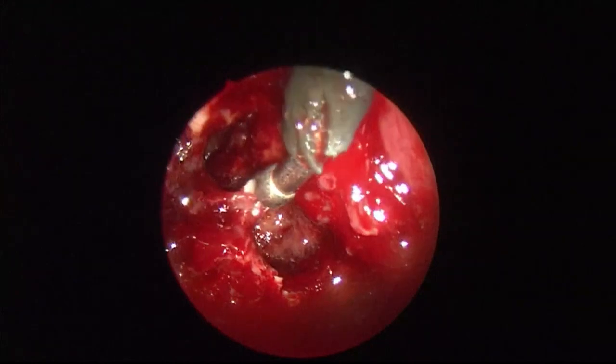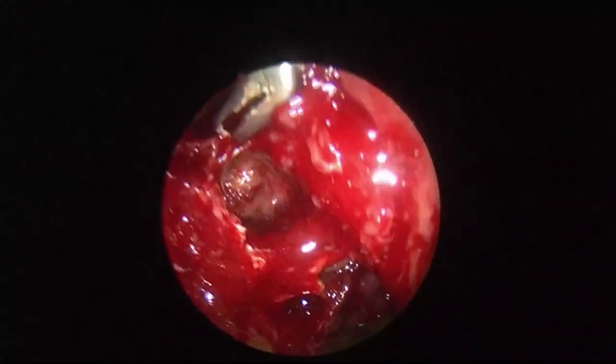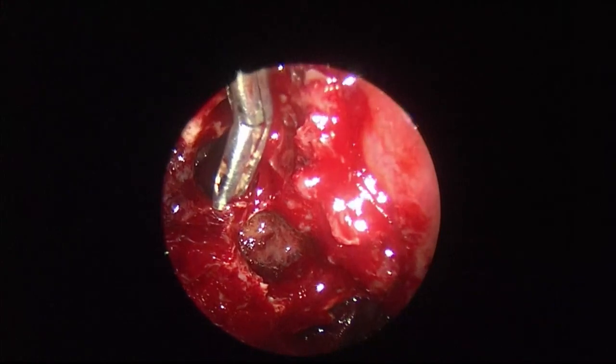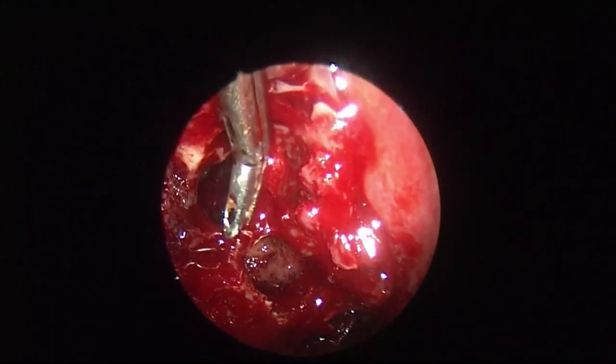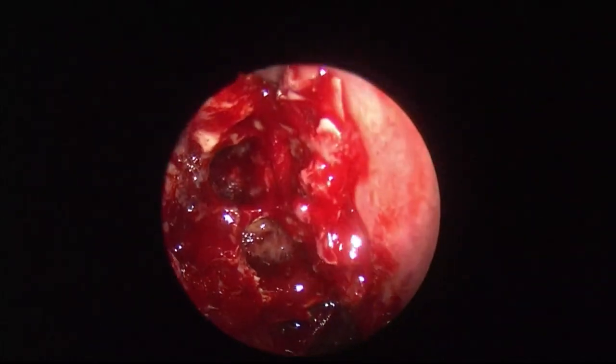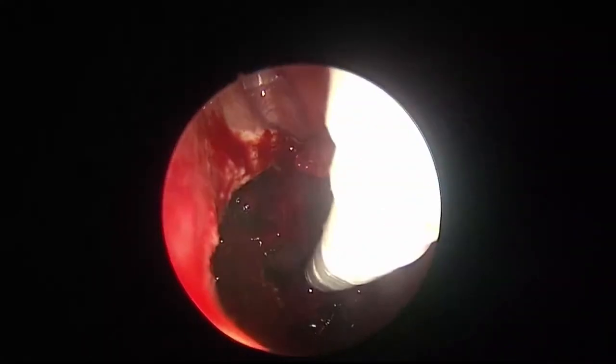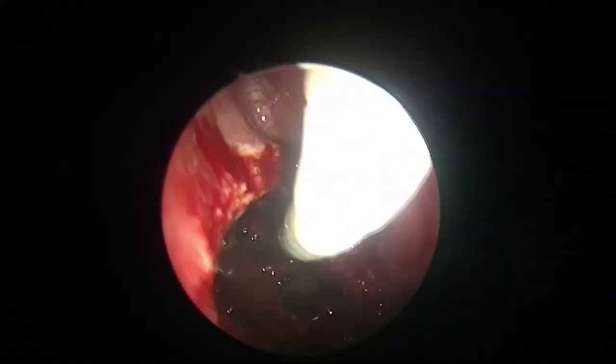This bone I will remove a little bit of the bone above the artery. Now the hydrodebrider. Even if the slightest fungus is left behind, it will come out with the hydrodebrider. See this. What is this? I told you this is a water jet.